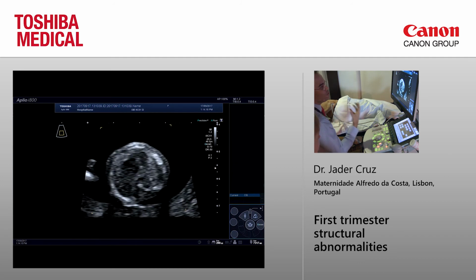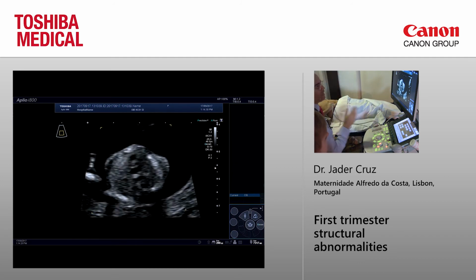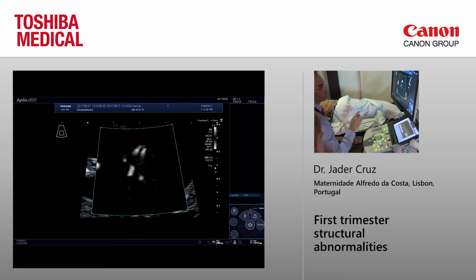And there is a new SMI. So the image I showed you was from the old SMI. I define things as new and old; they have new names for that. And this is the new one. I think the definition is even better than what we have.